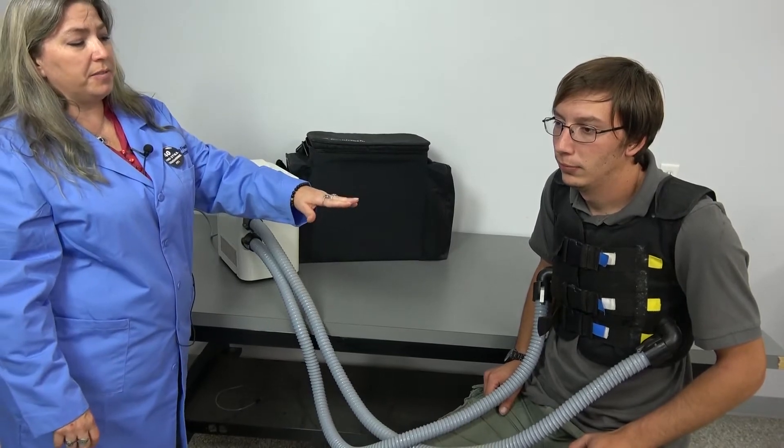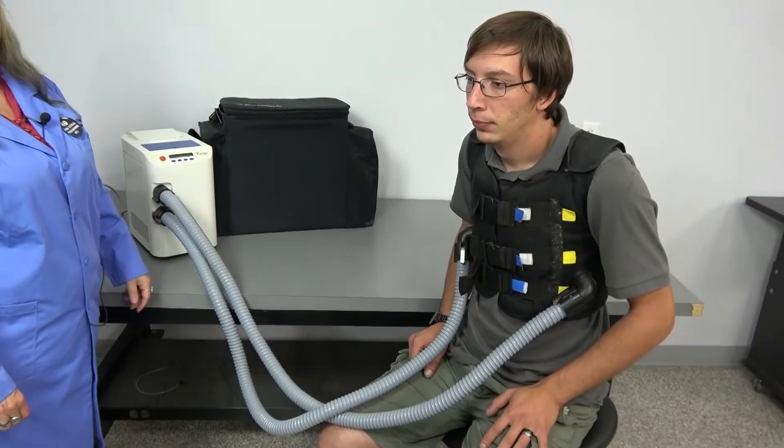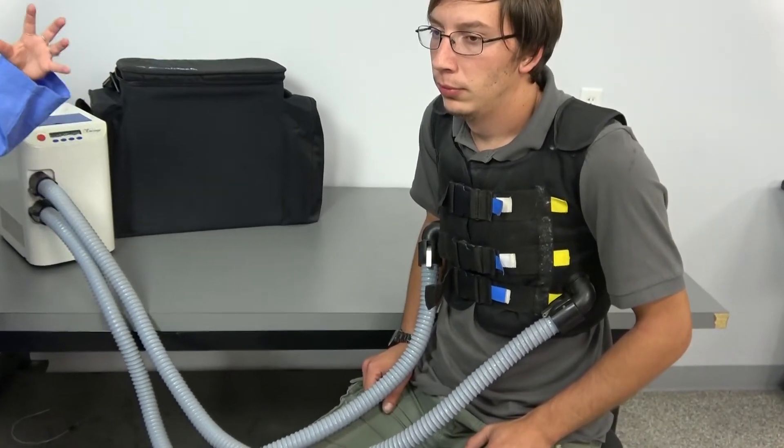The gentle yet effective compressions allow for the subject to breathe deeply while wearing the vest, unlike some that give a continuous compression.